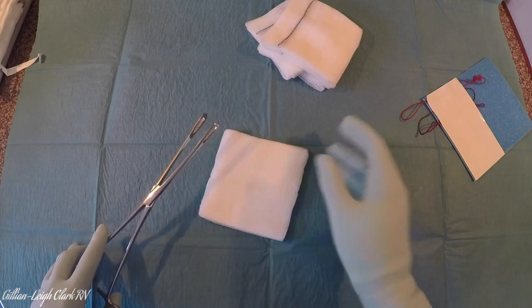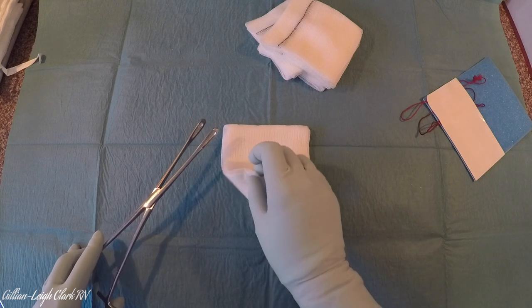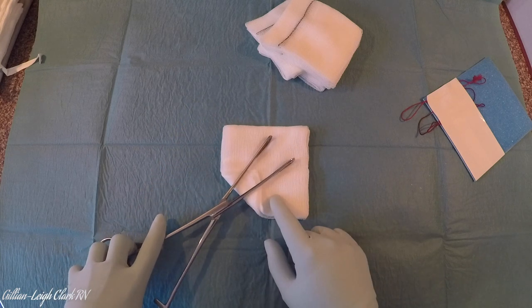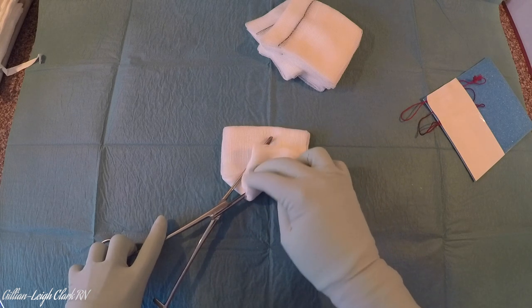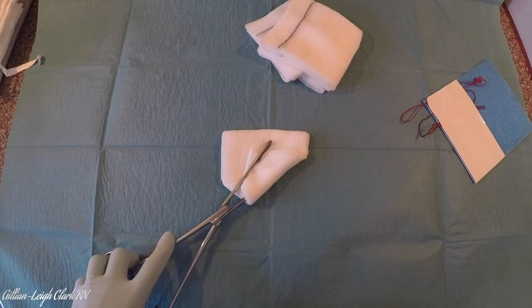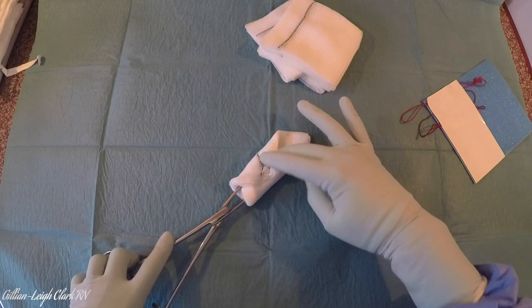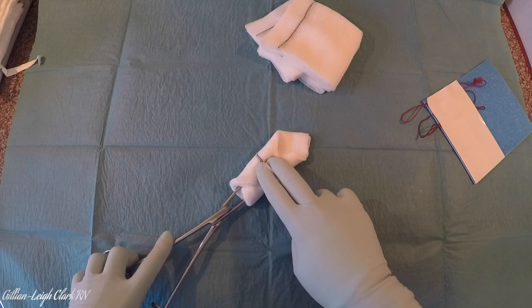I'm going to flip it over so the x-ray strip is pointing downwards. I'm going to lift the bottom corner up nearly to the middle of the swab — this is just for neatness. I'll lay my open Ramply on the swab. This corner I'm lifting over the right side. I'm going to lift the left side and tuck it under. The left side comes over and into the middle. Now I've got nothing to secure it, so I have to hold it with my fingers, and this is where it gets a little bit fiddly, because I have to get the top corner into the middle also.